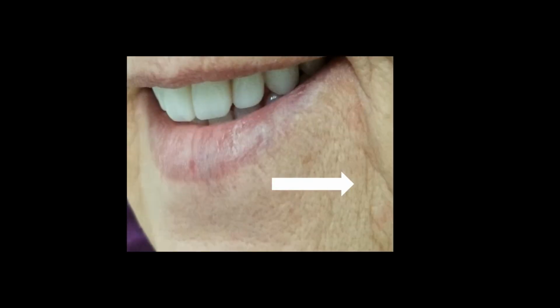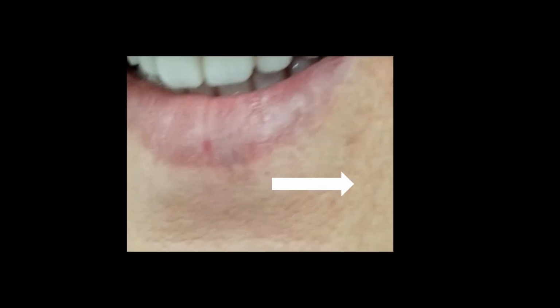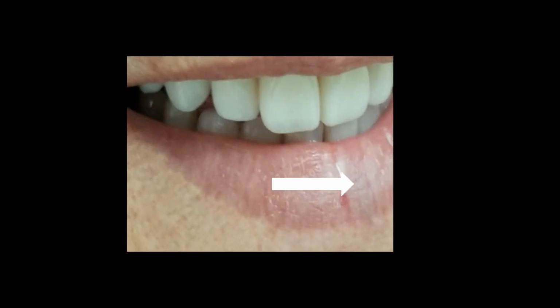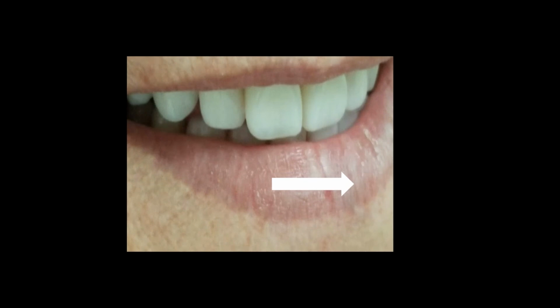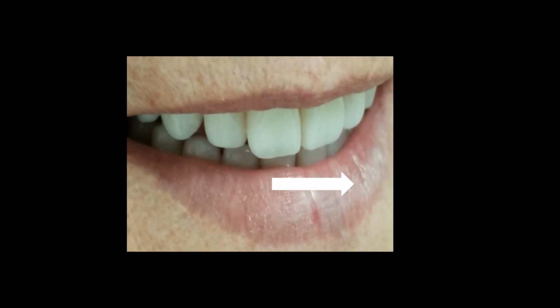You see how it swings out to the left? It's not swinging out to the right, it swings to the left. So now when she eats, by golly, guess what's going to happen? Because it's already there fundamentally in the building blocks of language. When she chews, it's going to fundamentally go out there as well and favor her left side when she's chewing food.